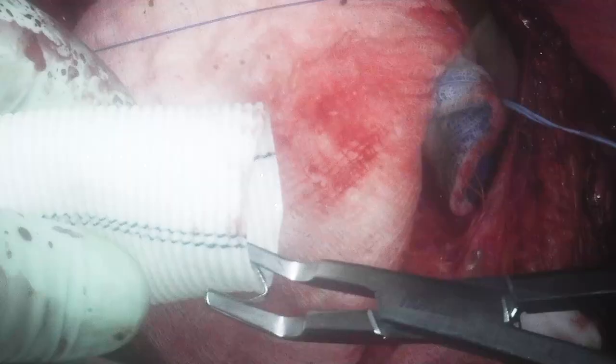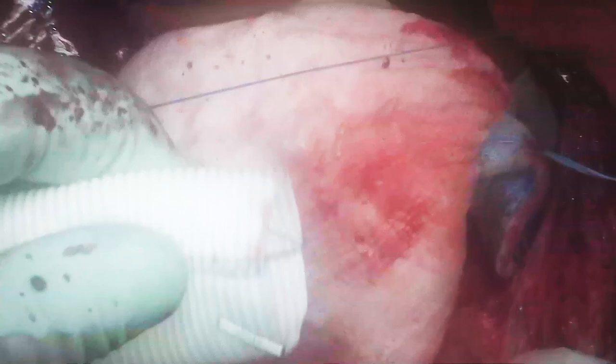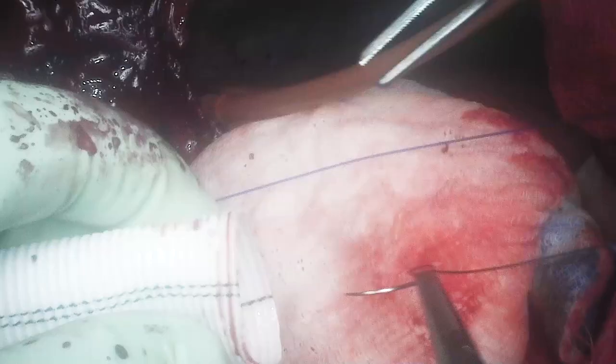Here are the clips going onto the distal part of the elephant trunk. I'm also going to attach a pacing wire to that so we can grab it and straighten it out at a later stage, if we decide to do the proximal descending with a stent graft and then the thoracoabdominal open. On the proximal end, we put a silk suture that we're going to use to pull the inverted tube graft out when we've done the distal anastomosis to sew to that. That is stuffed into itself — this is the inversion technique we use to push it into the tube graft.